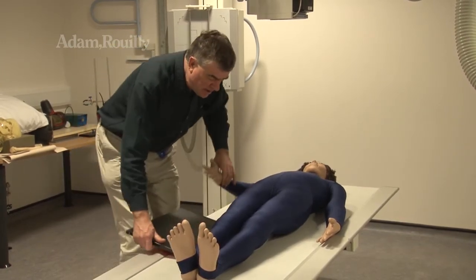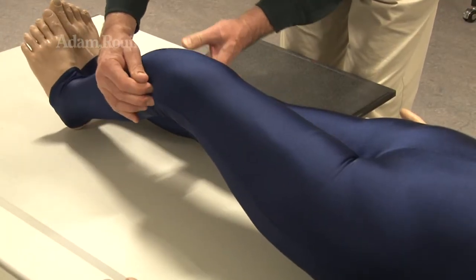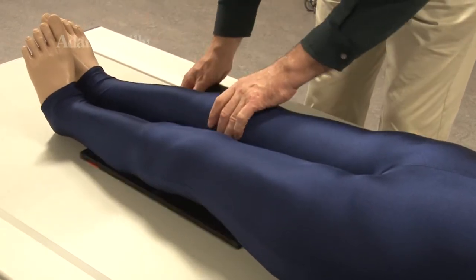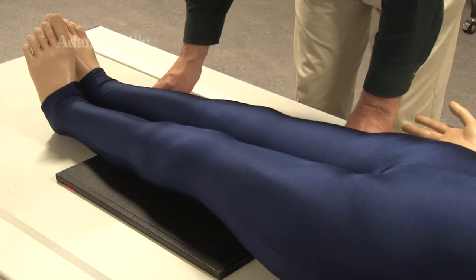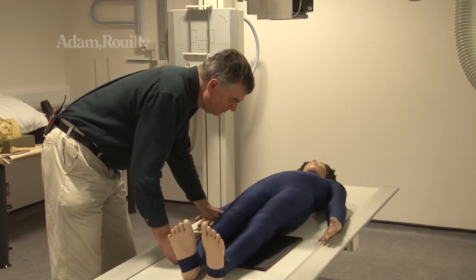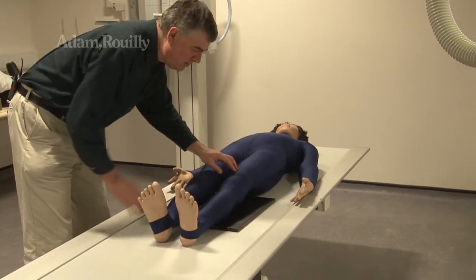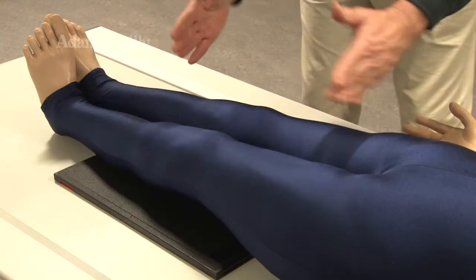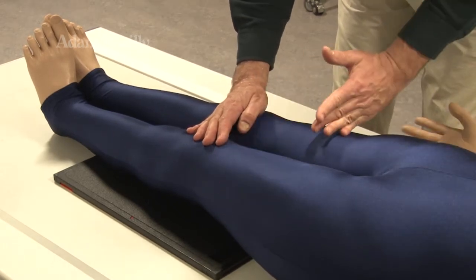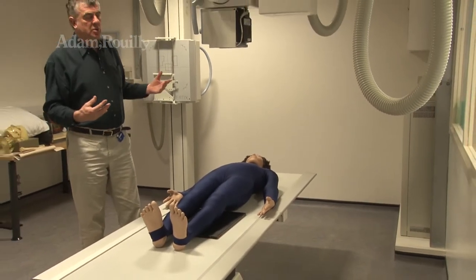So same procedure, but I've got to find where the knee joints are. So again, I'm palpating. That's where I can feel the joint. So that goes in the middle of the area of interest. And just to make sure that the legs look in a similar position. So by palpation, they are supposed to be symmetrical. But of course, the image will prove whether that's the case or not. And that, again, highlights why we do this, to make sure that internally the structures are as they should be to match true anatomical accuracy.